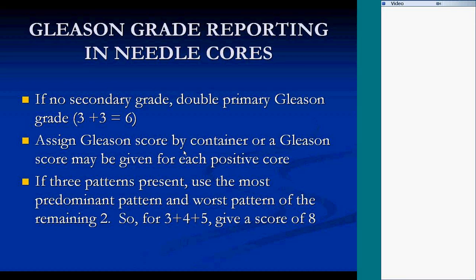This is important to recognize: there is a special way of handling tertiary patterns in needle biopsy cases compared to radical prostatectomy cases. In needle biopsy cases, if there are 3 patterns, you take the most common pattern, the predominant pattern, and then the worst of the remaining 2. This happens uncommonly in prostate needle cores, probably only about 5% of all needle core cases, but it does happen.